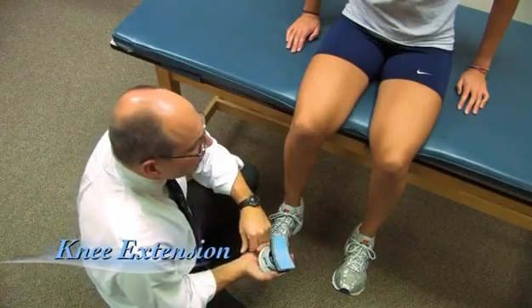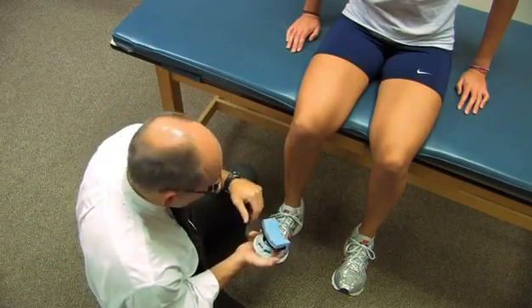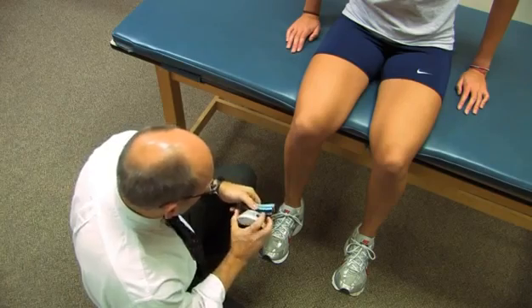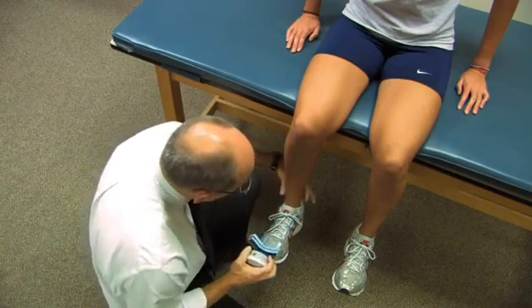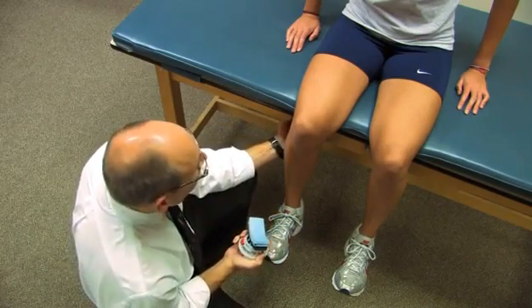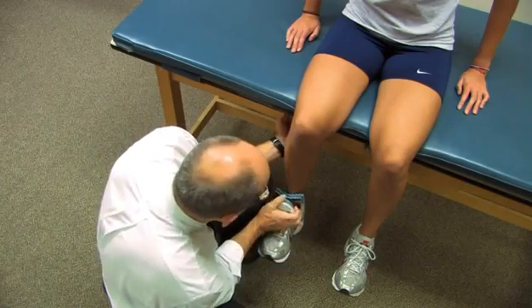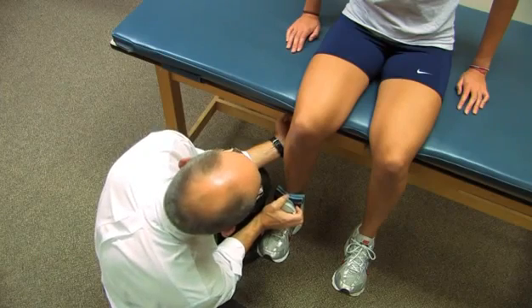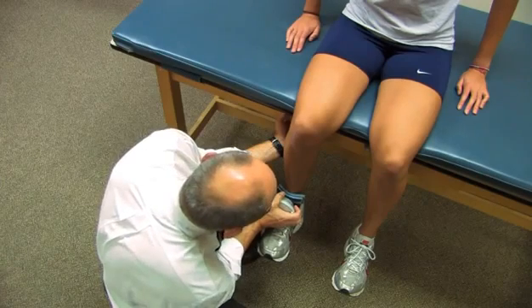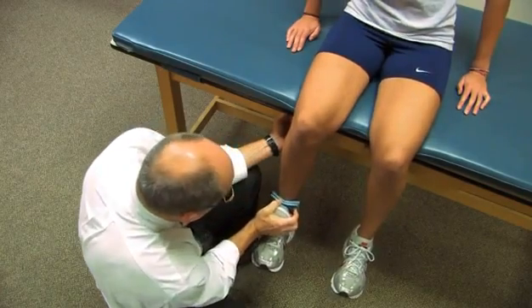Now we're going to measure knee extension. Very often there would need to be an additional individual to help hold the person being tested down. We're going to leave the leg hanging freely at about 90 degrees. I'm going to place the dynamometer just proximal to her lateral and medial malleoli. I'm going to hold onto the table because if the person is strong, I need to be stabilized so I don't get pushed away. Go ahead — push it out. And relax.